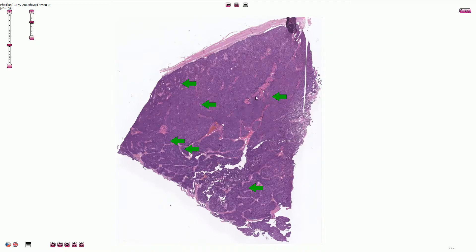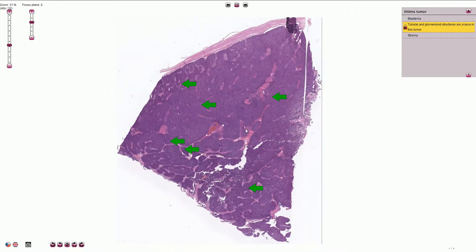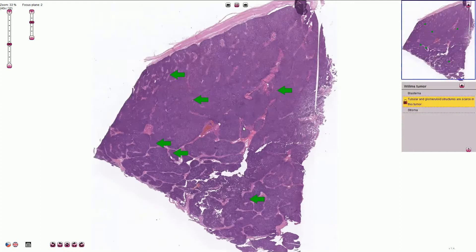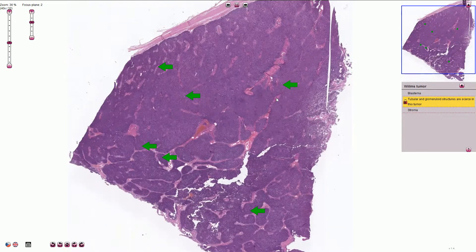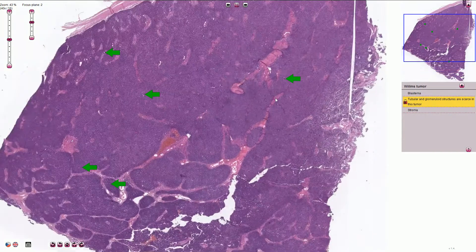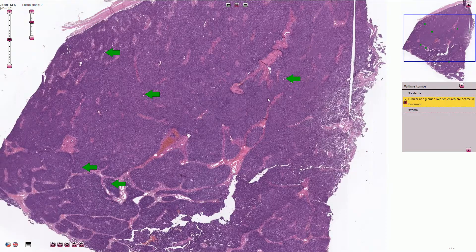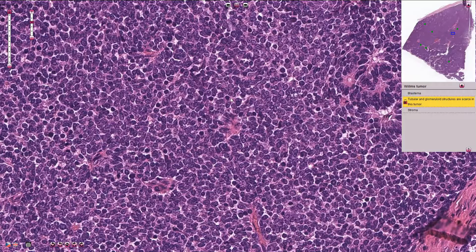On low magnification, the tumor typically looks like a darkly basophilic solid tumor, and we can typically find three components — not always, but usually. The most characteristic and most prominent is the undifferentiated blastemal component. If we randomly zoom in, we can see all of these undifferentiated small round blue cells in the solid pattern.